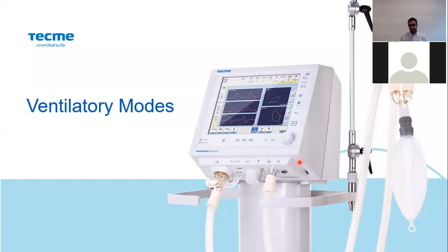So those are the general ideas about all the ventilatory modes. So you have to understand clearly that you can control only one variable. For example, the pressure or the volume, you cannot control both. So this is the main classification here, or the main concept that you have to keep in mind.